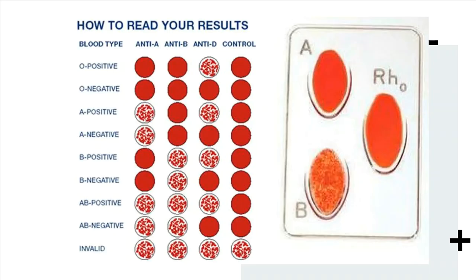And then finally, this is what you're looking for when you blood type yourself. So here's another blood card. This did not agglutinate or clump in well A. This did agglutinate in B, and we did not get agglutination in RH. So this probably means that this particular blood sample is type B negative. So B minus is going to be the answer to that particular question if you see that in some lab activities. Here are just examples of what you would see.